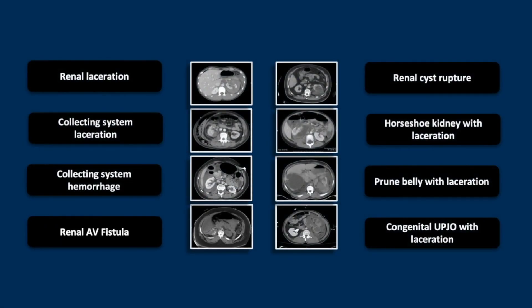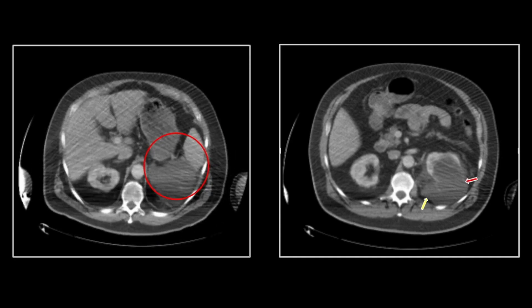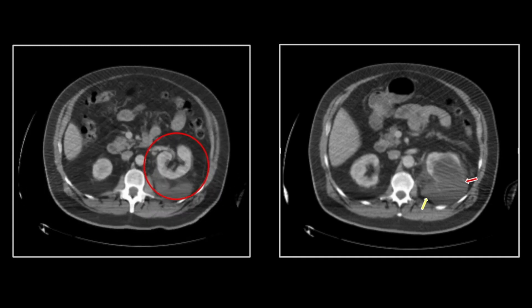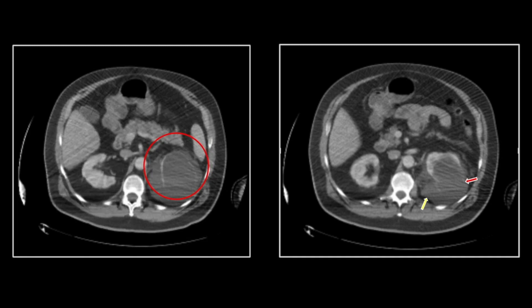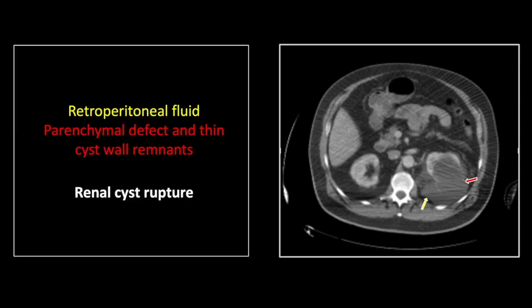Our next case is the traumatic rupture of a benign renal cyst. I'm actually surprised we don't see this more often given the frequency of renal cysts; however, it is a relatively unusual finding. You can see relatively hypodense fluid in the left perinephric space and the flaccid, collapsed thin wall of a benign renal cyst. You can see the collapsed walls of that cyst. That is a traumatic left renal cyst rupture.